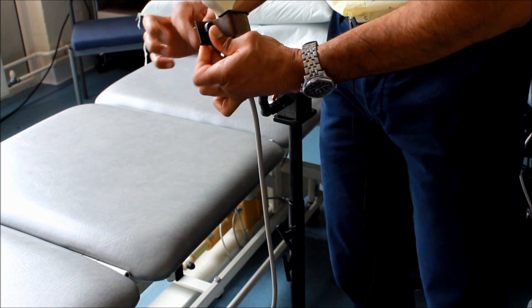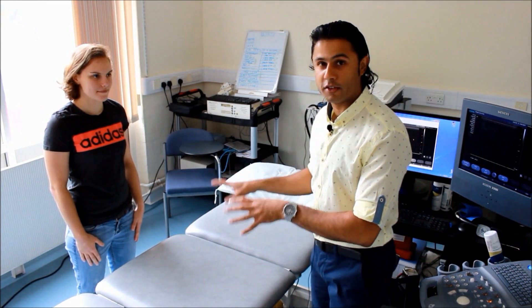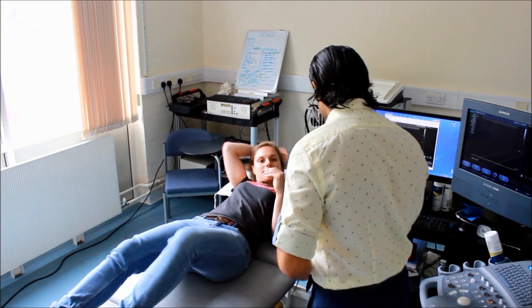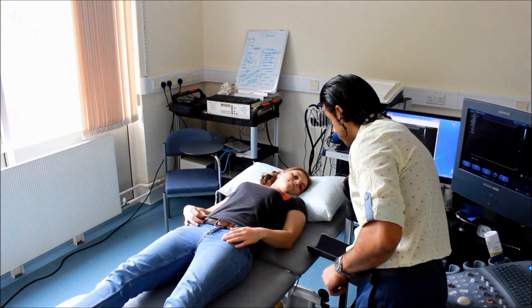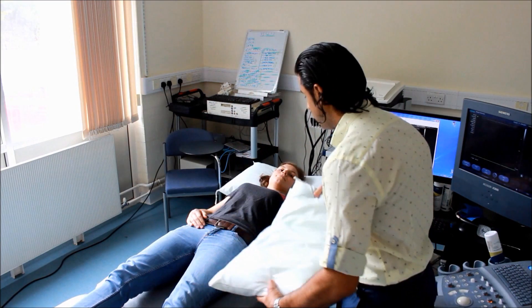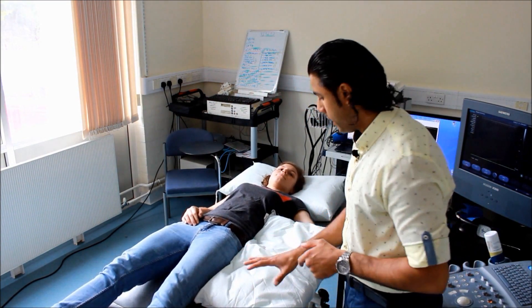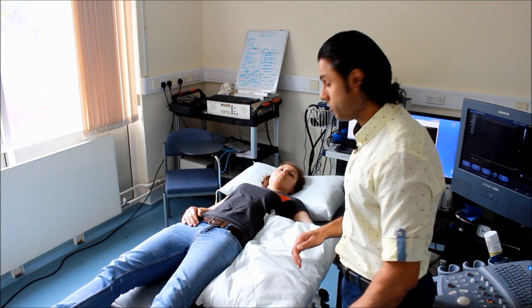You would literally just slot the probe into place and then tighten down this locking clamp and you would be ready to do the assessment. The next thing is to get your participant comfortable lying supine on the bed, making sure they're in a very nice position. You can use an arm holder and place another pillow to give a little bit of support to the participant, and also allows you to rest your own arm for the nine minutes that this technique is going to take.